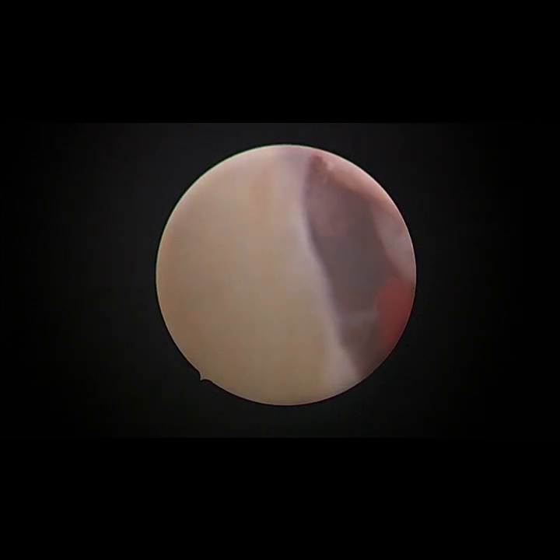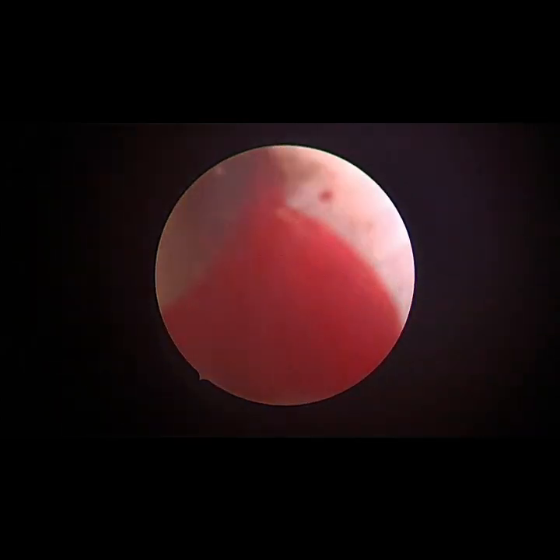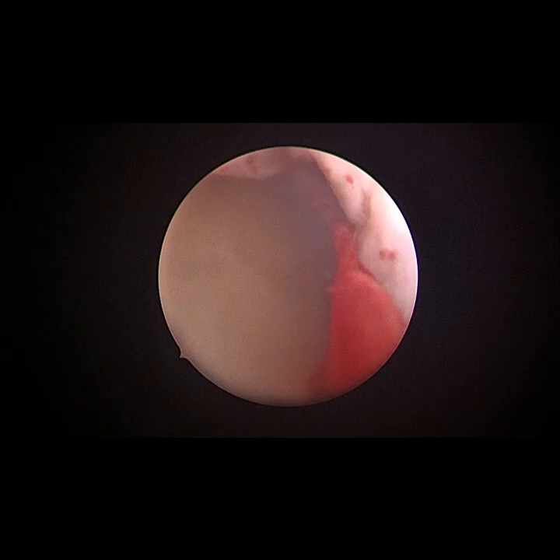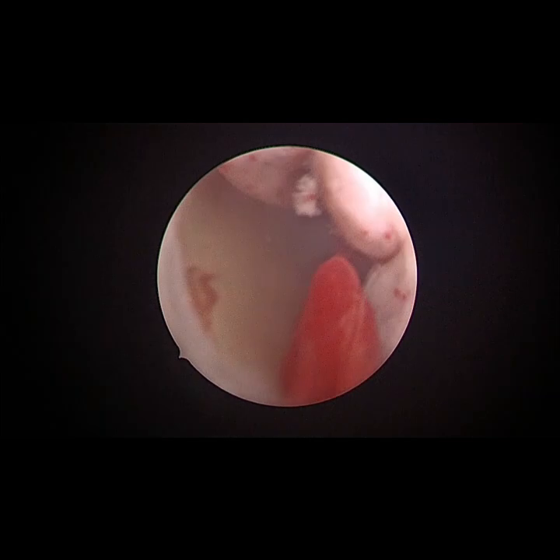As this is a case of degeneration in a 20-year-old male, we have to see the cause of very early degeneration in a male child. So we are suspecting infection or tuberculosis or any kind of metabolic disorder in this child. But looking at the synovium, we suspect that this might be an infection, as degeneration is present in both hips. You can see thick synovial fold along with the acetabular labrum.